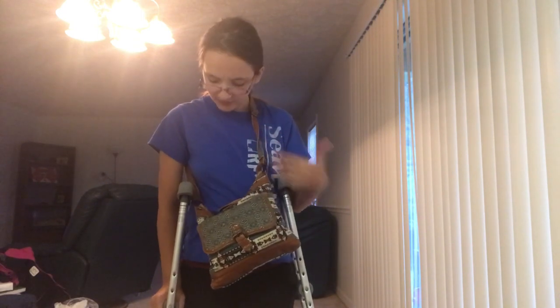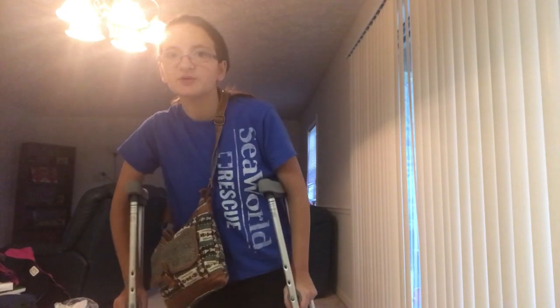I put my purse over, it has a shoulder strap, so I put it over my neck and behind, but instead of carrying it on my side, I kind of carry it out in front of me, and I'll back up, hang on, let me adjust the camera here. I'll back up a little bit to show you, so that it's not getting in the way of me walking with the crutches. It's completely out of the way. I tried to do this at first, and then I was like, well, this isn't gonna work, it's getting in the way. So I carry it like this.